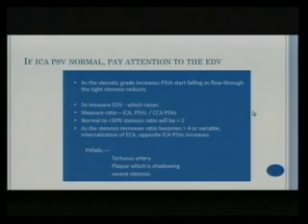So what happens is as the stenotic grade increases, you go from 52% to 60% to 70%. So as the stenotic grade increases, peak systolic velocities start falling as flow through the tight stenotic segment reduces, right? Initially you see that the peak systolic velocity will increase, and that's why you have 125, 230 as your parameters to gauge your stenoses. But over time it starts to compensate because it's a stenotic segment, less blood flow goes through it.